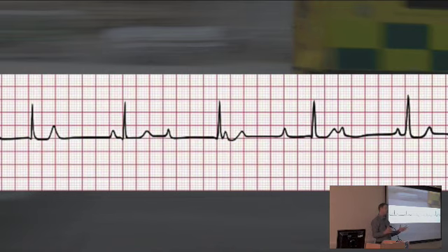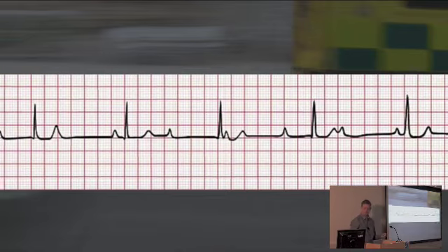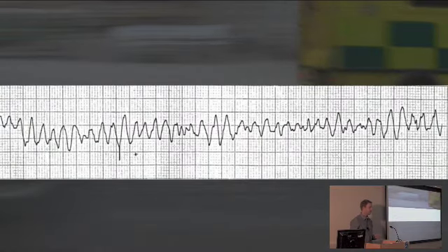You'd normally have a broad QRS complex that's coming from the ventricles rather than the atrium. Or it might be that this escape rhythm is being generated from the bundle of His, and that's why you get a narrow complex. So a complete heart block, you'd really worry, wouldn't you? We'd be thinking that this patient might be unstable, we might need to try atropine, which doesn't often work in complete heart block, and we might need to get them paced urgently. This rhythm is a spot diagnosis.